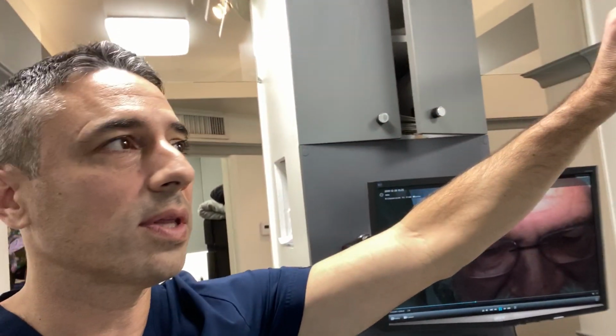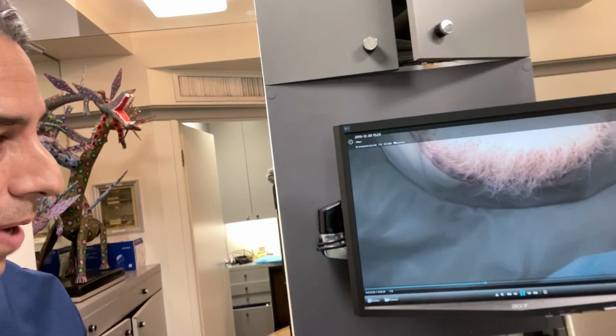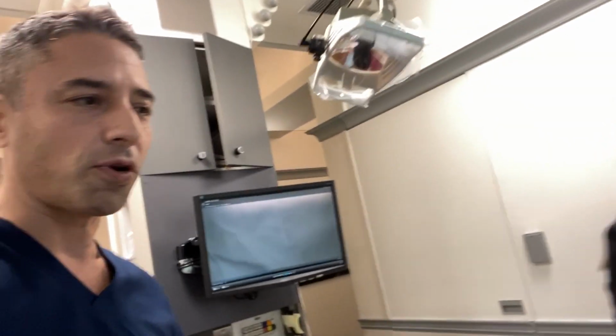We also recorded this surgery with the 4K camera, which you're seeing right here. You see just the patient's beard, but all the surgery was recorded, and you can tell here it took 33 minutes. Part of it is just downtime of the patient waiting for the anesthetic to work. So literally, it took about 15 to 20 minutes of proper work. Patty's confirming here.